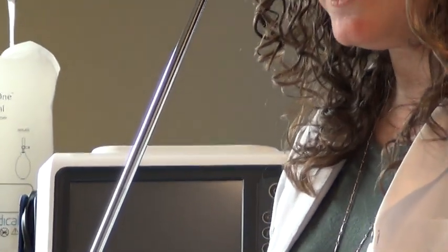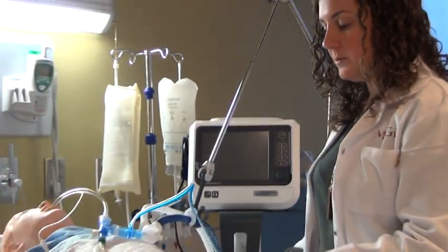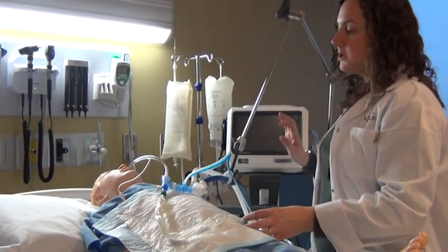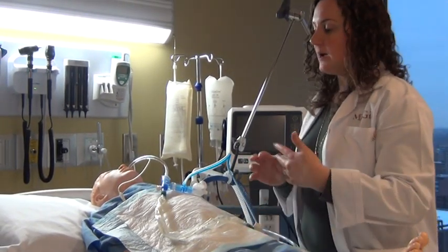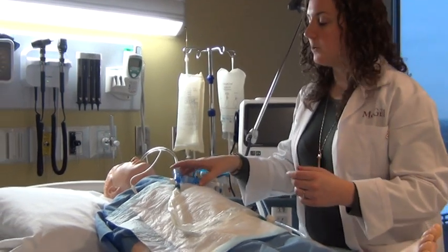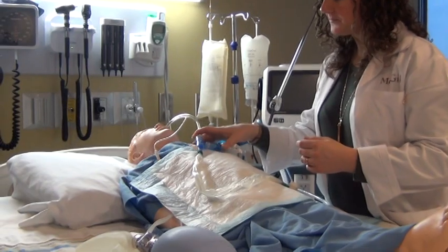So once we're ready to suction, what we would do is remove the safeguard here on the tube. We would give a 100% bolus to our patients, and then we would be ready to suction them. We would obviously inform them that we're going to do such a maneuver.